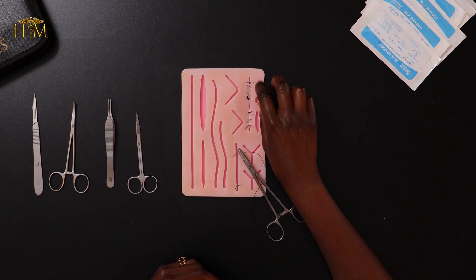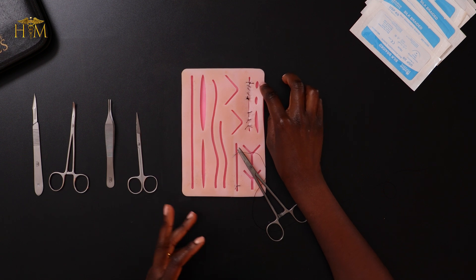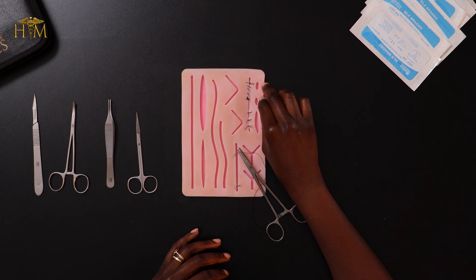What that leaves you with is a hole that is pretty much circular — this one is of course a bit more oval shaped. A really useful suture to know how to tie to close those types of wound is a figure of eight suture, and it's super simple so I'm going to show you how to do it.